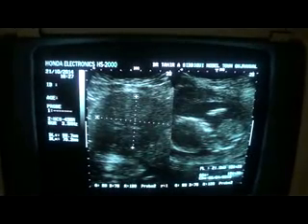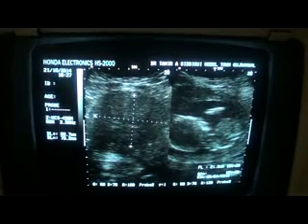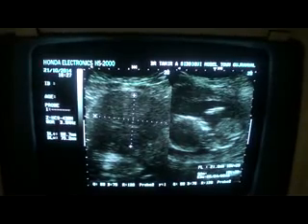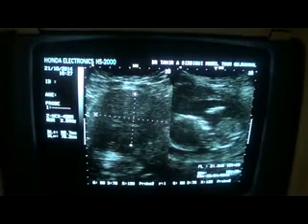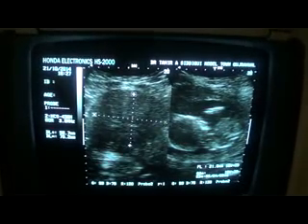So this is our case of the day. Two fibroids, a 13 mm dilated cervical canal with the amniotic fluid being pushed there, and the lower segment displaced. Fetus of 16 weeks, but the fetus is normal. Thank you very much.